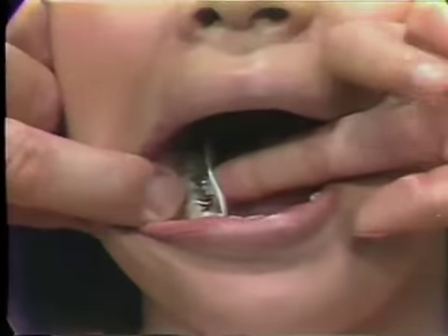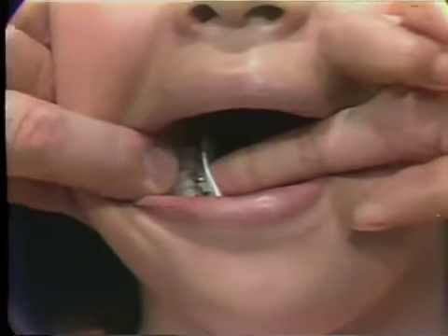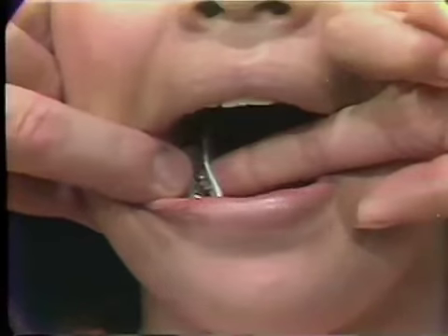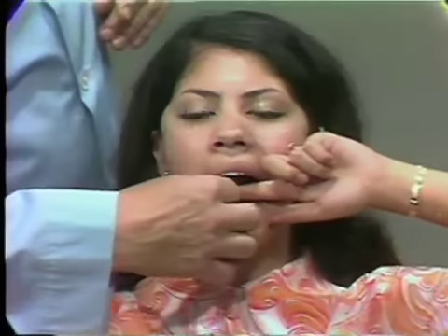There you can see the film packet in position. Its front edge is about in the middle of the second bicuspid. A small amount of border protrudes above the occlusal surfaces of the teeth. We will aim the X-ray beam in the same direction indicated by the occlusal surfaces of her teeth. We direct the center of the beam at the center of the film. Then the exposure is made. Then the machine is removed, the film removed, and the patient dismissed.